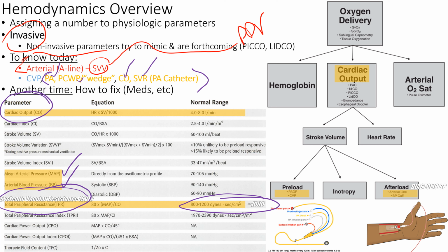Because sometimes you do what are called designer hemodynamics. Like, look at my CVP, it's 8. Look at my SVR, it's 1,000. Look at this one, look at this one, and then you'll titrate your medications up and down, add other medications. You realize, in the end, the patient's eating breakfast. It's like, we don't need these numbers. We'll let them ride.